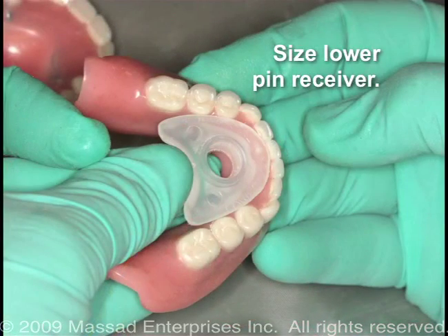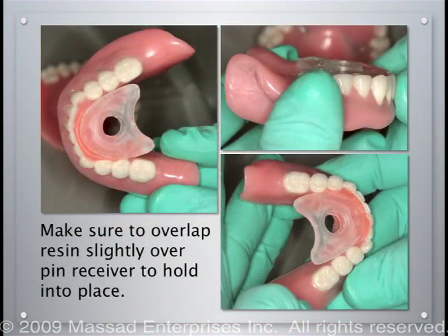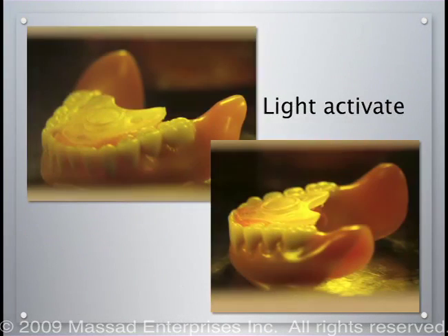The lower pen receiver was adjusted to fit slightly beneath the occlusal surfaces of the teeth. With the use of a light-cured resin, this is applied and the pen receiver is compressed into the base plate to be secured. Once this is adjusted properly, a small amount of resin is lapped over the top in order to give additional retention. This is then light cured until completely polymerized.